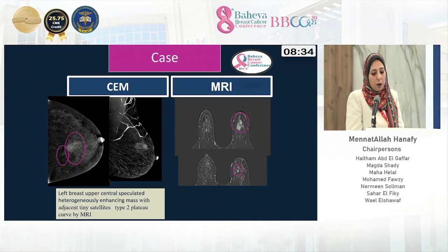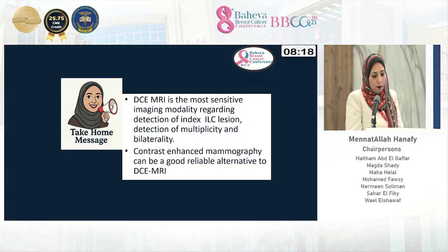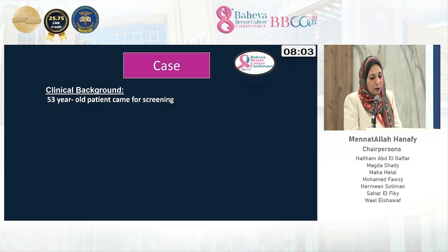Both contrast-enhanced mammography and MRI were comparable in this case, showing left upper central spiculated heterogeneously enhancing mass with adjacent tiny satellites. And the final pathology was invasive lobular carcinoma multifocal grade 2. So our take-home message is that dynamic contrast-enhanced MRI is the most sensitive imaging modality regarding detection of index lesion, multiplicity, and bilaterality. However, contrast-enhanced mammography could be a good, reliable alternative.